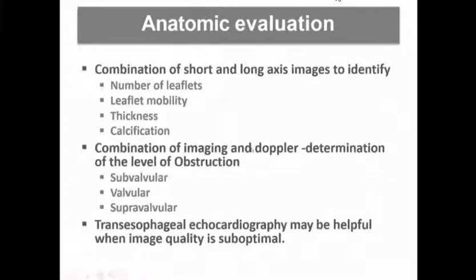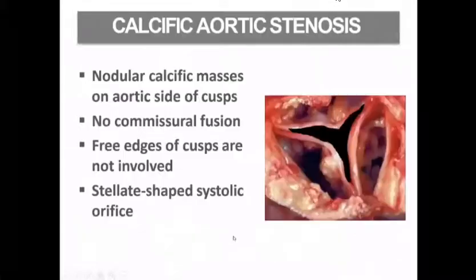Whenever you do the anatomic evaluation, you look at the leaflets, mobility, thickness, and calcium, and whether the stenosis is supravalvular, valvular, or subvalvular. TEE you can do when you are not getting a high quality image and it is suboptimal; then you go for the TEE.